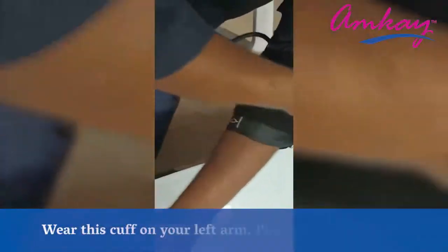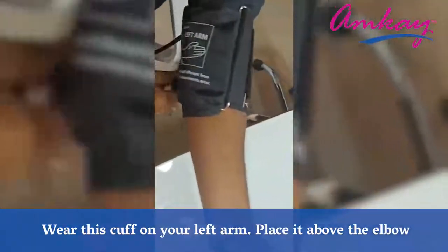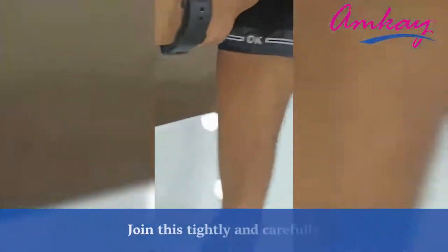Wear this cuff on your left arm and place it above the elbow. Join this tightly and carefully.